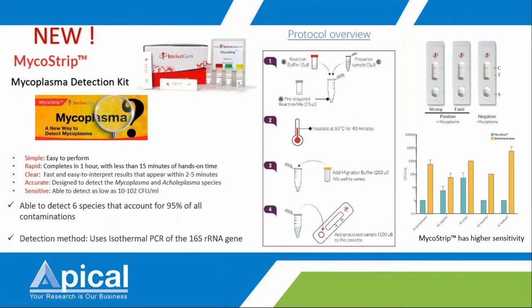This is actually the new kit that has just come into the market, which is the strip. This particular kit is a very simple and very rapid detection kit. It is something like the pregnancy test, right? The kit looks something like that.